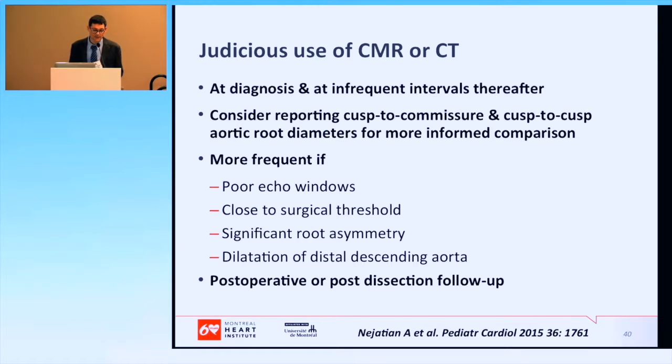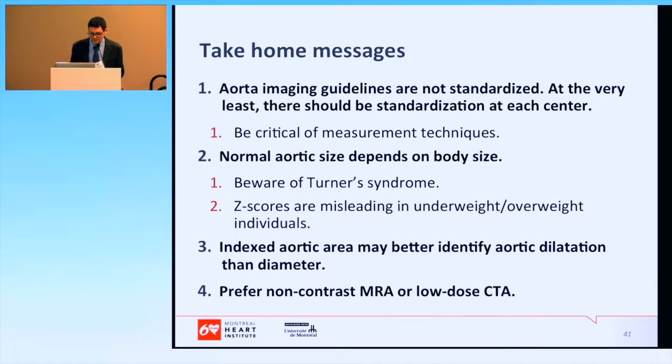CTA and MRA are also a key part of postoperative imaging. So another take-home message is that the non-contrast MRA or low-dose CTA may be the preferred imaging for aorta measurement.